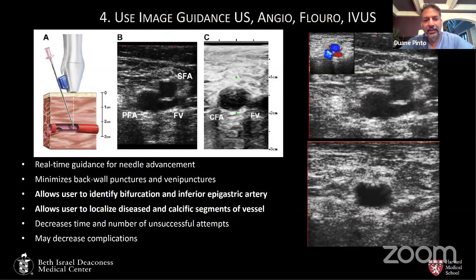What I'll tell you is, as cardiologists, we very frequently access in this common femoral cross-section, but the vascular surgeons very standardly access in the longitudinal view because they want to see the wire going in and actually not ulcerating or unroofing the posterior plaque. So I would suggest to you to practice both so that you can get facile.